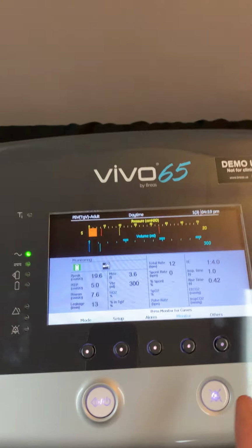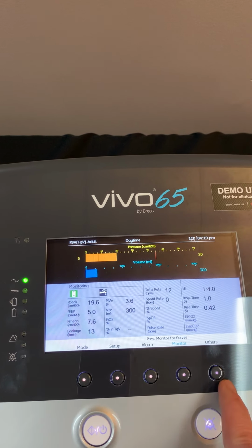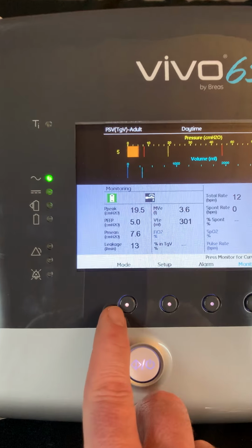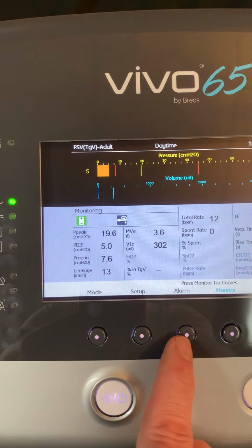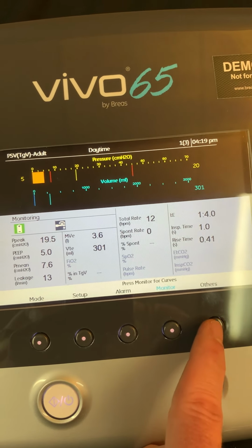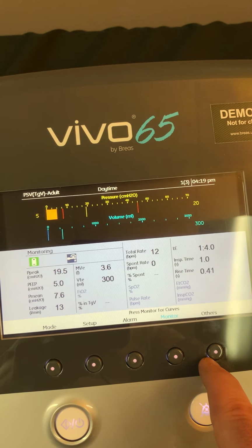You've got 5 menu buttons on the bottom of the screen. All those menu buttons are labeled right above. This one is currently labeled mode. Okay, this is our setup. This one is labeled alarm. This button is labeled monitoring. And then this button is labeled others. So these are our 5 menu options.